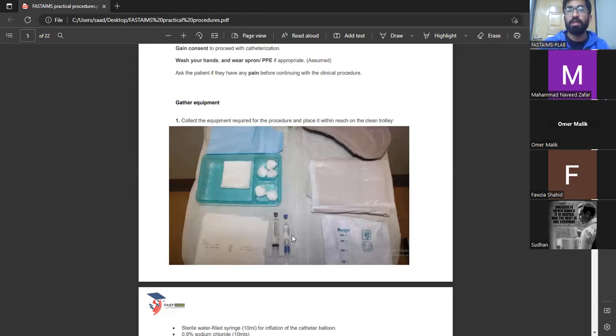So pass the catheter; you will feel a little bit of resistance when passing through the prostate. After passing the catheter, you need to inject sterile water. Okay, so three things have been done, and then let the urine come out into the kidney tray.